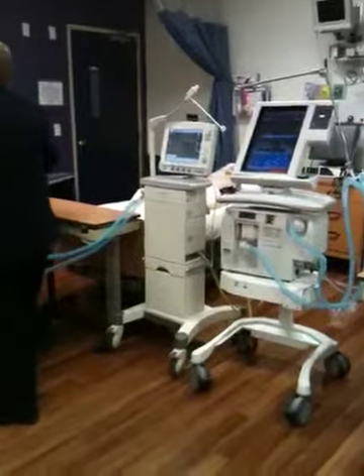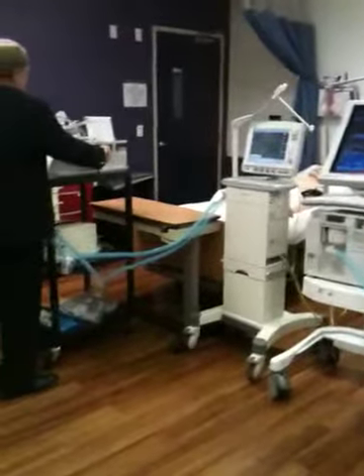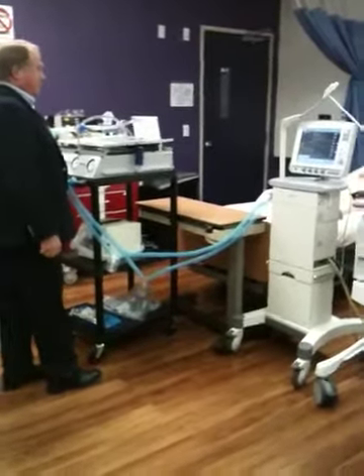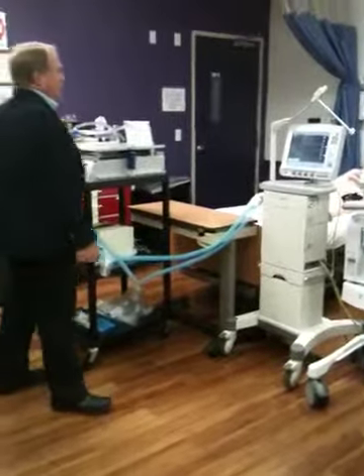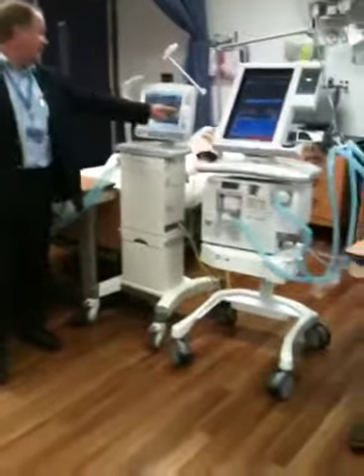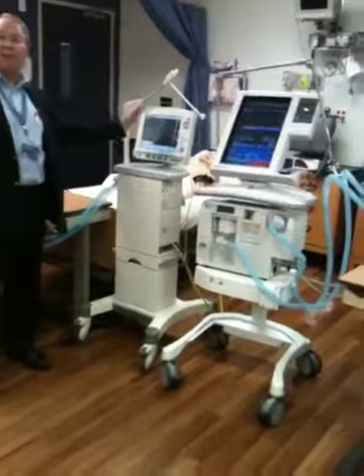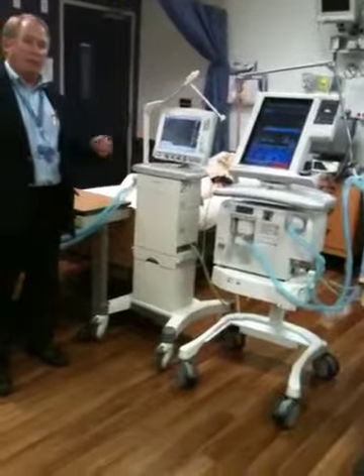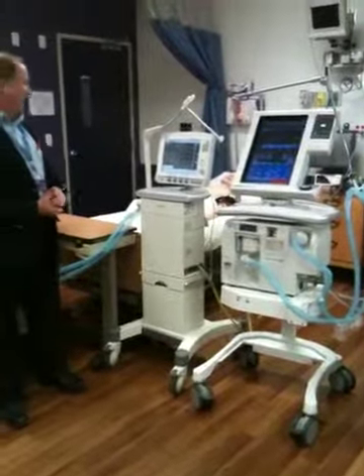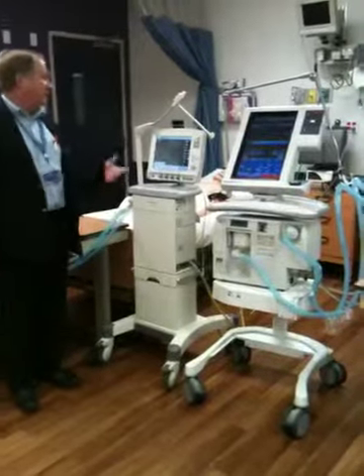If something changes with my patient, now my curve went more upright and my compliance went to 64. So I can look at the graph and say, I know it went up. I look at the numbers and it tells me how much it went up. Now the one thing is, on this particular ventilator, it's not going to give me a static compliance, it gives me a dynamic.